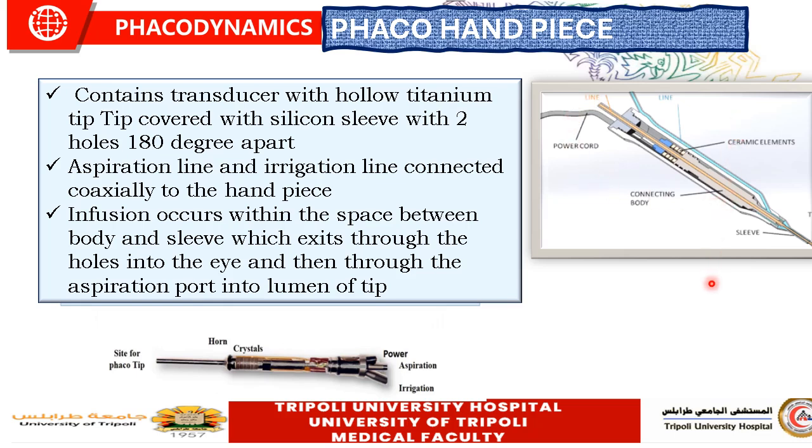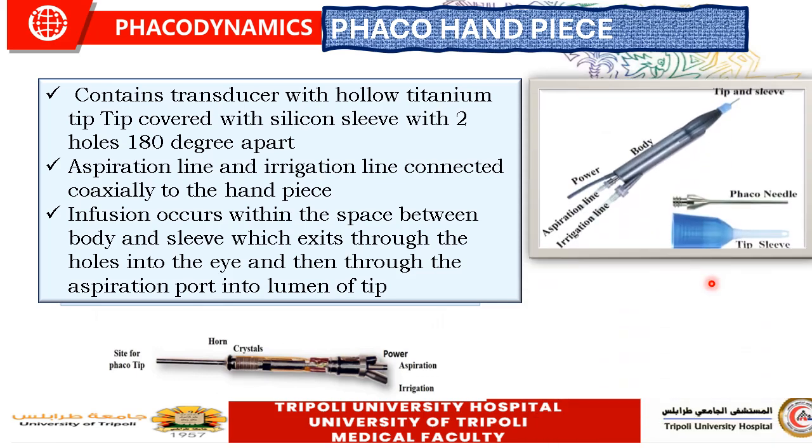The importance of the handpiece is that it transmits the electrical energy connected to the piezoelectrical crystals to the Phaco needle, so it is transmitted as mechanical energy, which is responsible for the to-and-fro movement of the Phaco needle. So this is the main component.